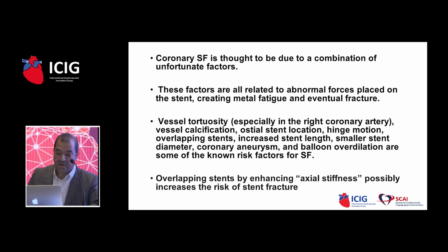This is what I had, and increased stent length, probably balloon overdilatation, as I had to prep my lesion several times. That might exhaust my stent and probably cause this axial stiffness and cause it to be fractured.